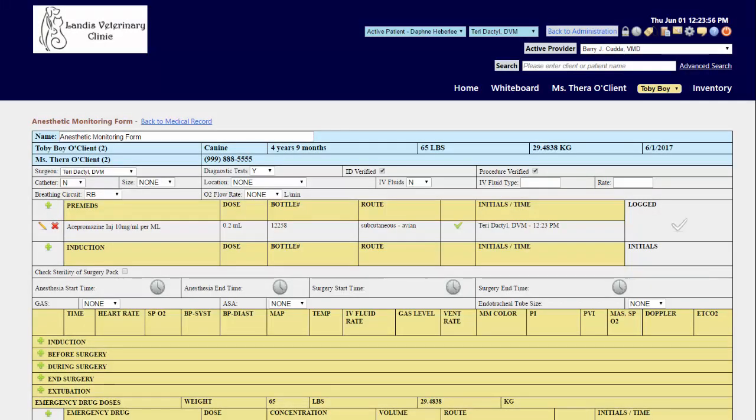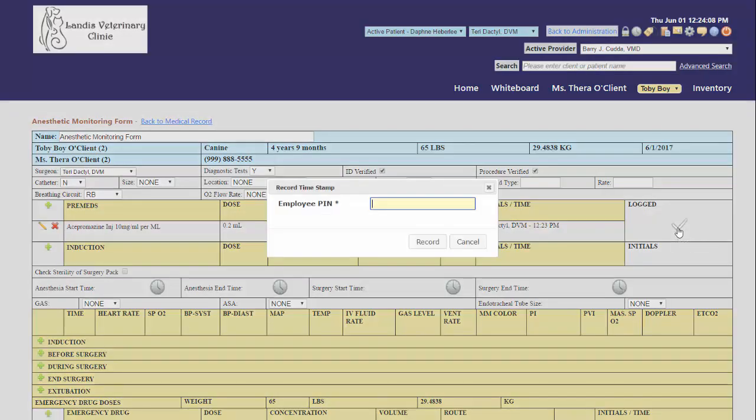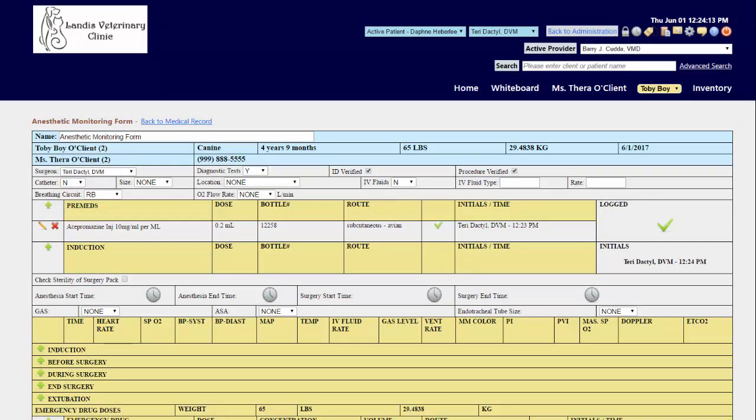Once all pre-med and injection drugs have been given and the patient is good to begin surgery, click on the check mark under logged to indicate that you have given approval for surgery. Again, enter in your PIN number and click record.